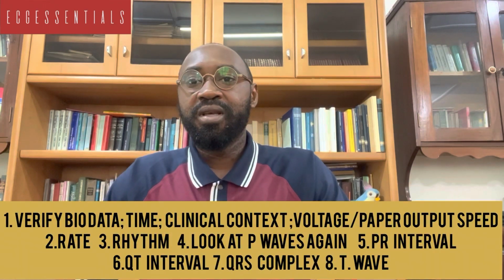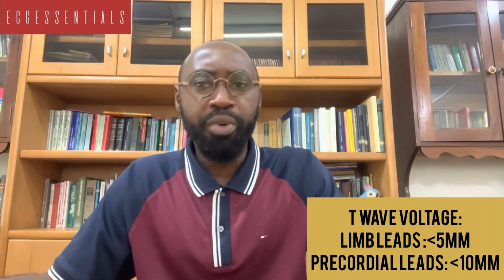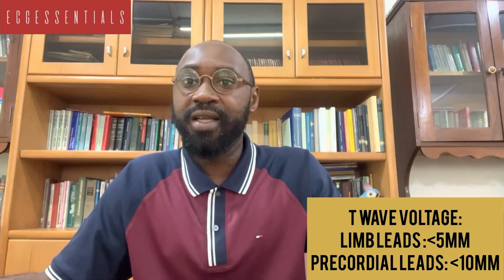T waves will be the next thing to talk about. And T waves, we have said earlier, they represent ventricular repolarization. And T waves are upright in all these except AVR and V1. When we are looking at the T wave, we are interested in the amplitude of the T wave. And in all limb leads, the amplitude should not exceed 5 millimeters. And in all precordial leads, we expect that the amplitude of the T wave should not exceed 10 millimeters.